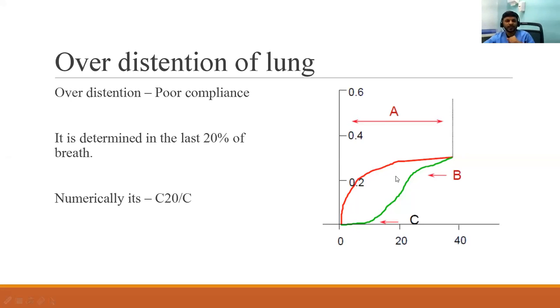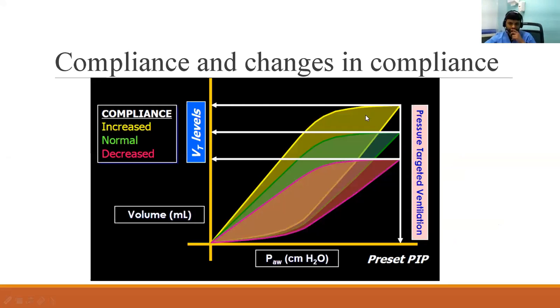So this we see when we are trying to desperately increase the PIP and PEEP and FiO2 to try and get the baby to oxygenate in settings like PPHN or pulmonary hypoplasia. So the moment you see beaking, probably we need to stop and take a step back in terms of PIP.